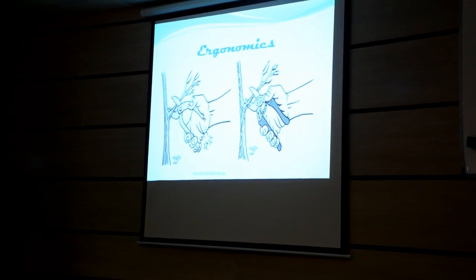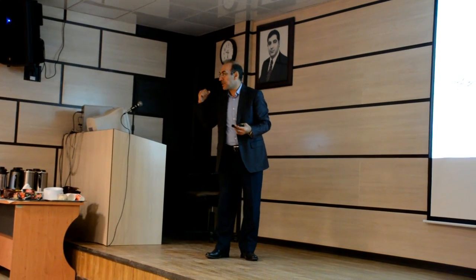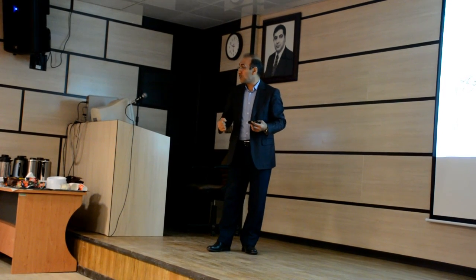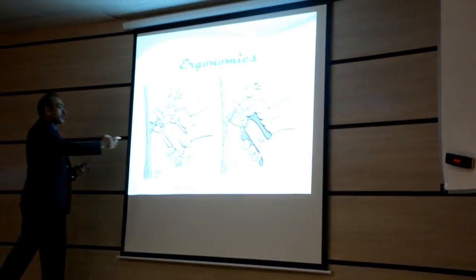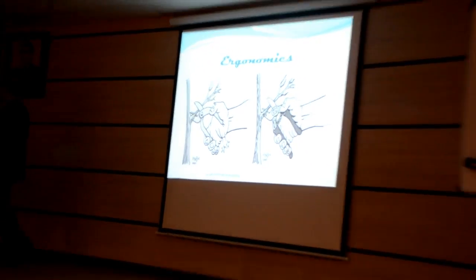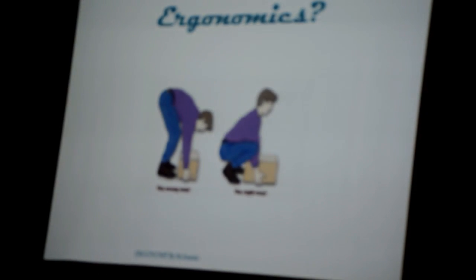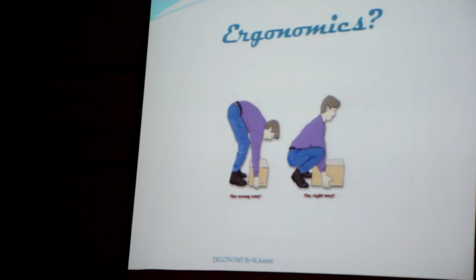In beginners, after any laparoscopy, the assistant or the surgeon has a backache, pain in the neck, and goes to the bath, takes a shower, goes for a massage, especially surgeons who do not exercise well. Look at this branch with this instrument and that instrument. You can feel which is easier and better. To take a heavy object up, this is the right way and this is the false way.